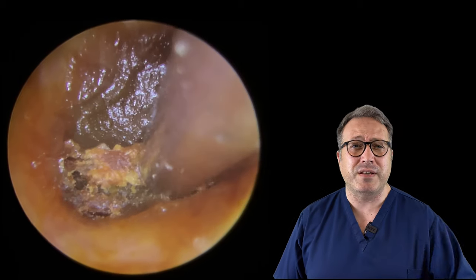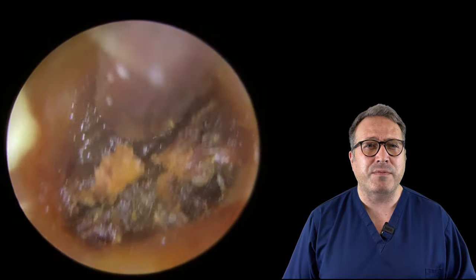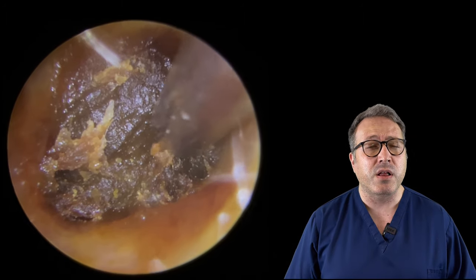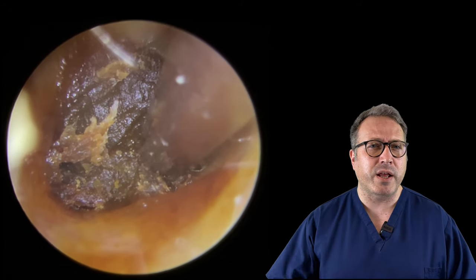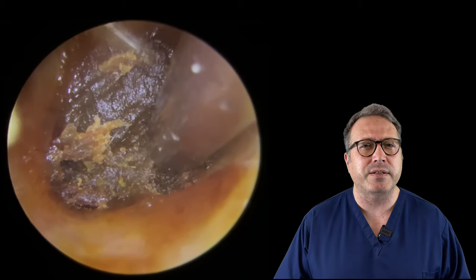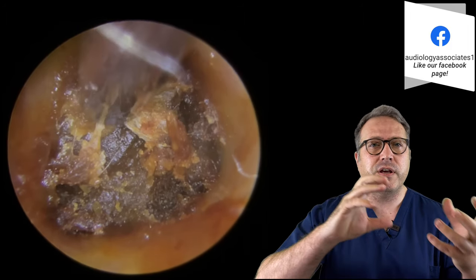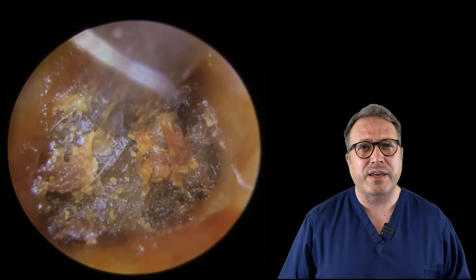Obviously, as you could probably understand, this lady was really, really struggling with her hearing and had been like this since April, I think she said - quite a long time to be stuck like this. She was having a little bit of difficulty on the other side but nowhere near as much as this one, and the hearing on this side was far more intermittent - you'll see why that is just in a second. We're just really probing this wax at the moment, trying to pull as much away as we can, looking for any looser, softer, or just a little bit more maneuverable pieces of wax.